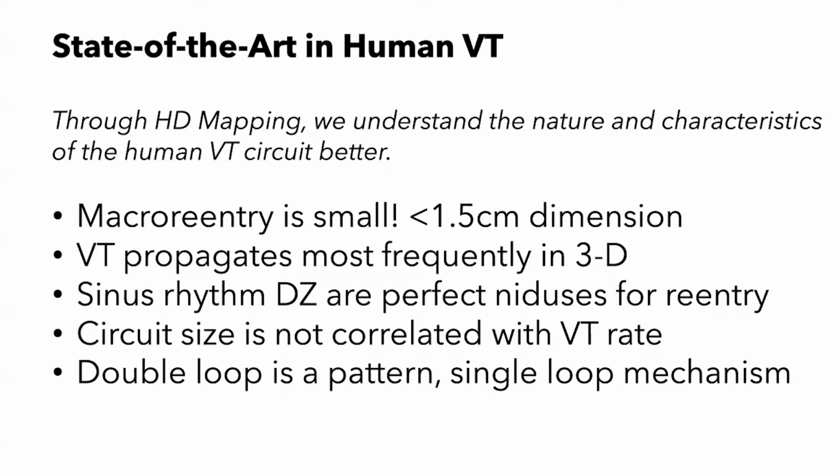The circuit size did not appear to be correlated with VT rate, and double loop figure of 8 patterns are merely patterns and not mechanisms. And when we start entraining these, we start realizing that maybe half of the butterfly is only the active portion.